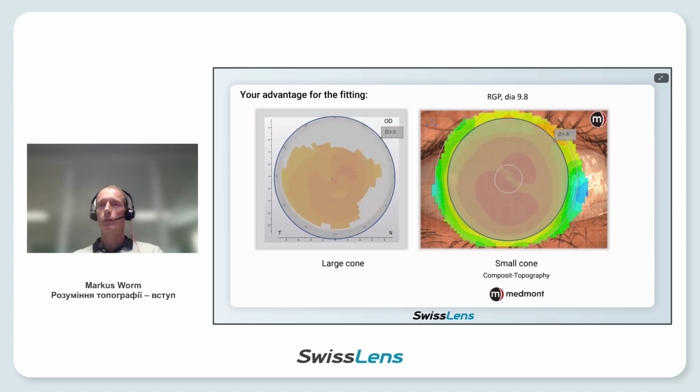What's your advantage for the fitting? Well, let's just put a normal RGP lens with diameter 9.8 on this eye. And what you can see is that quite a large part or area of the contact lens is not covered by the topography of the large cone. The white zone here you can see is not measured, whereas the small cone gives data far beyond the lens, as you see well colored here.